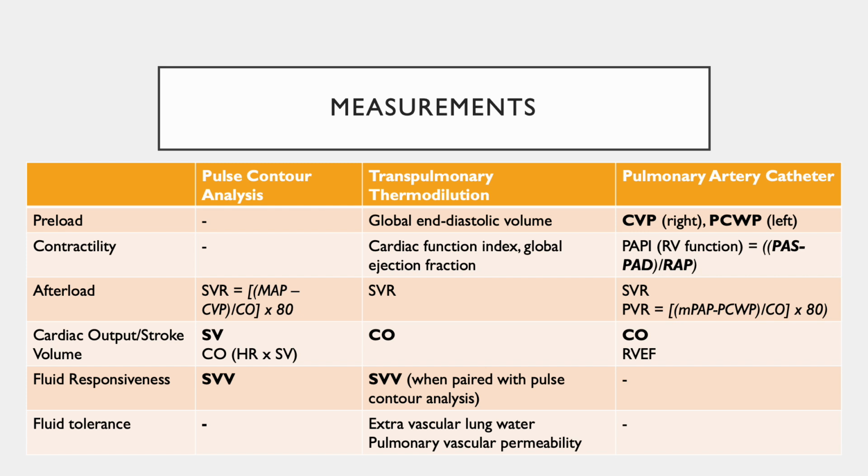Secondly, it is also important to note which parameters are actually measured, as seen by those bolded, in contrast to those that are derived from equations. These will be explained in detail as we go through the different modalities.